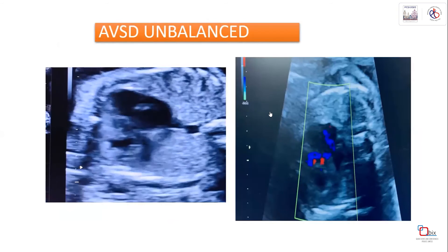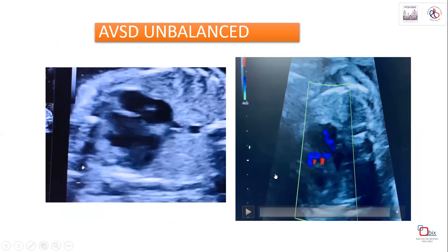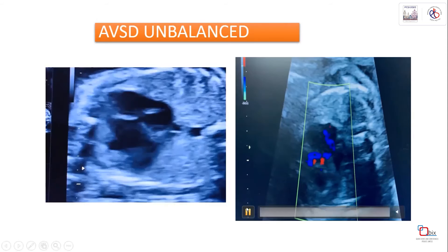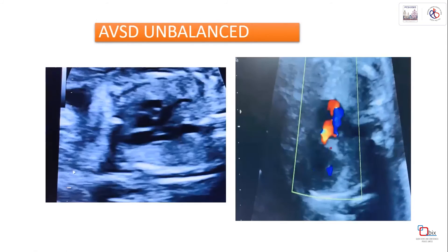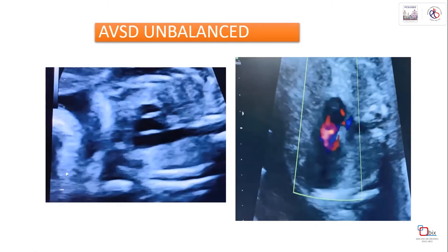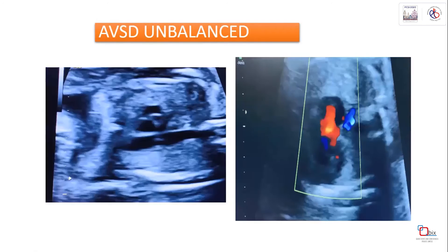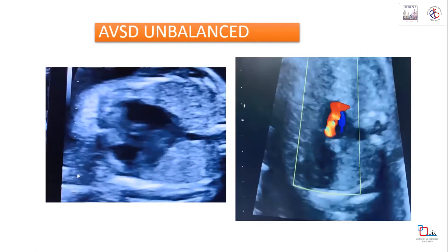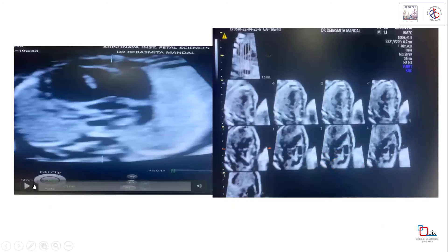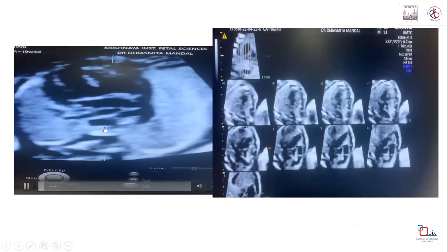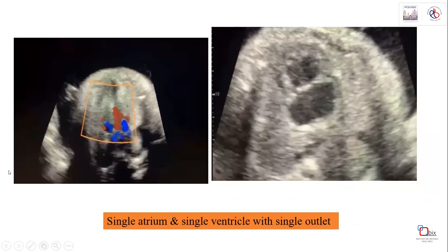This is a case of unbalanced AVSD diagnosed on a low-end machine. The diagnosis was made not only from the flap anatomy but from blood flow - a large combined inflow from both atria into the ventricle with no clear valve differentiation, demonstrating how AVSD appears on 2D and color Doppler.